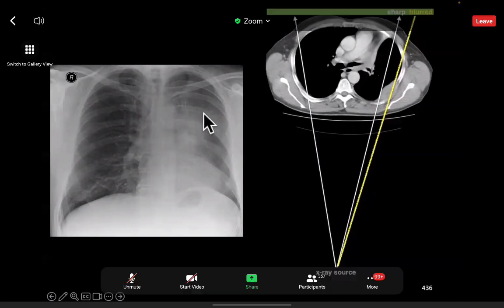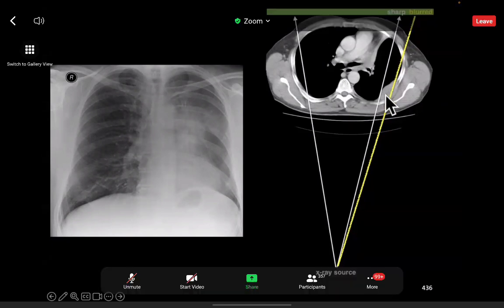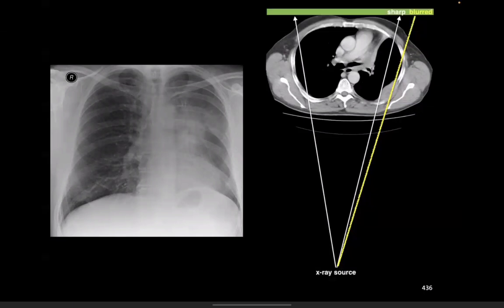And in fact, that patient did have a rib metastasis. If you were going to biopsy anything, it's probably better to biopsy that, because most radiologists would agree that that's going to cause minimal patient suffering, really. They probably don't even need a bronchoscope if that reveals the diagnosis, because it upstages the patient and is relatively non-invasive compared to endobronchial biopsies, etc., etc.